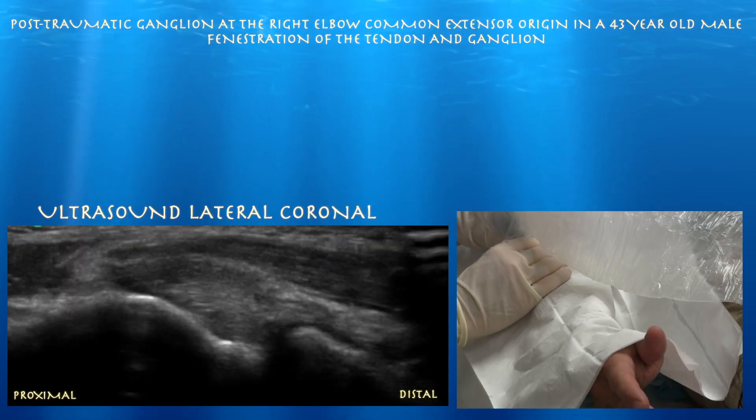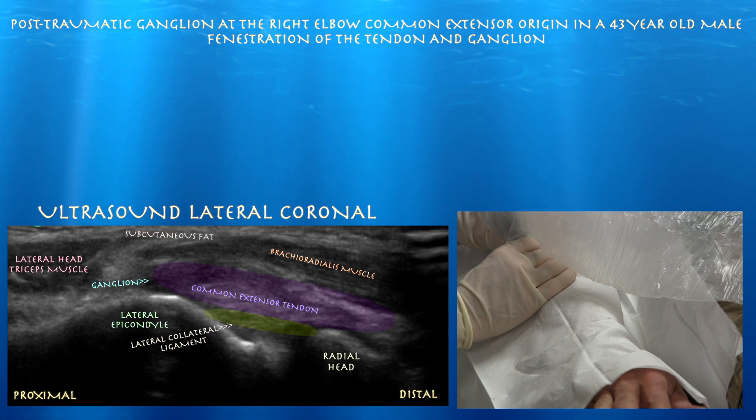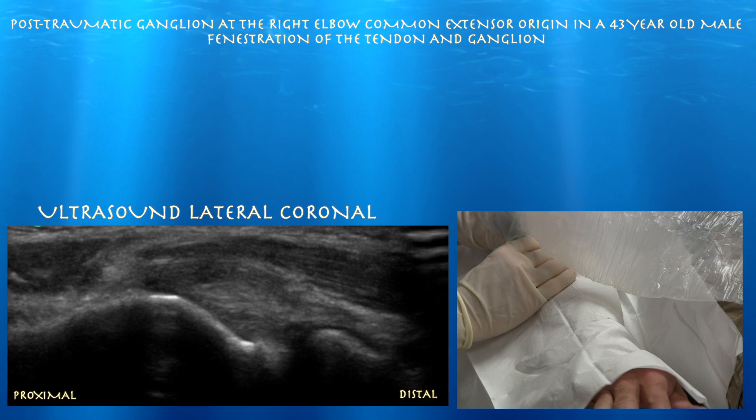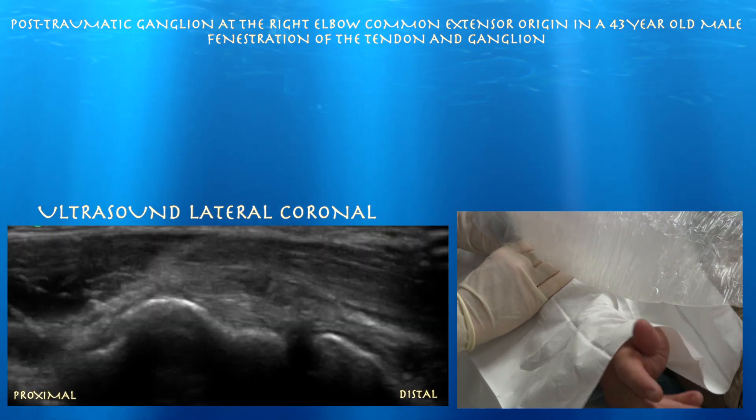We're just having to do active pronation and supination a little faster. Here we can see a thickened common extensor tendon, and there's some hypoechoic signal proximally near its insertion, and there's a focal area of dark signal consistent with a ganglion.